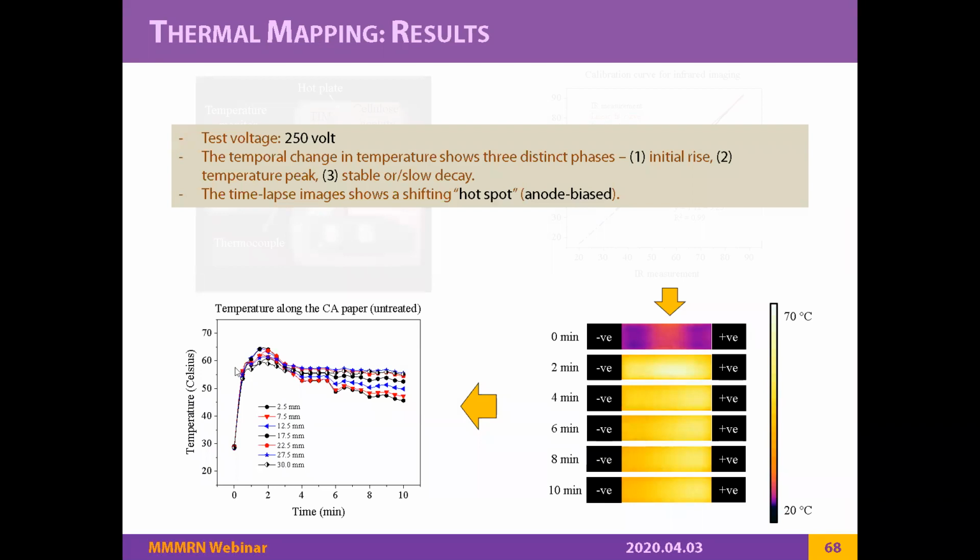At this level, the hemoglobin already gets denatured and its nature and mobility change. If we don't allow the evaporation, the temperature will go even higher, right? It will degrade the hemoglobin even more. So in a sense, the evaporation is a blessing in disguise, but it caused us the imaging problem. So we decided to take care of the imaging problem, not eliminate or minimize the evaporation. Does it answer your question?